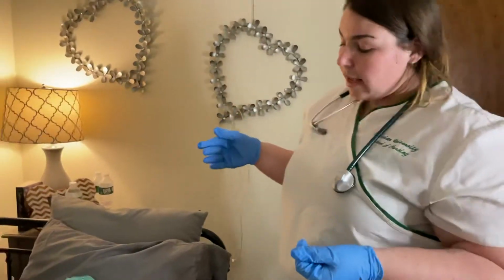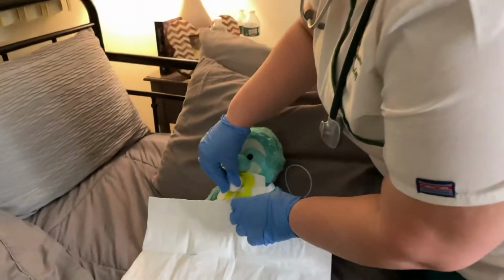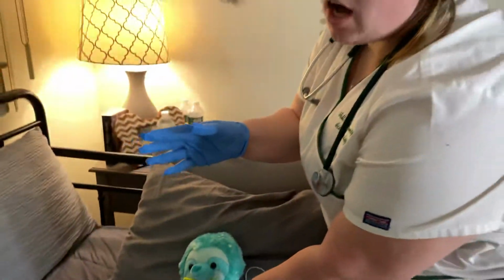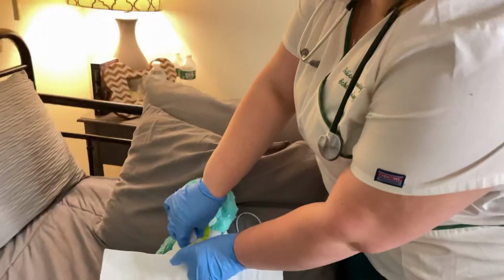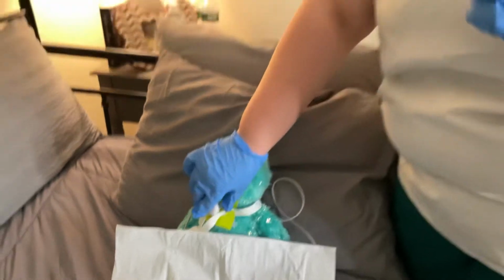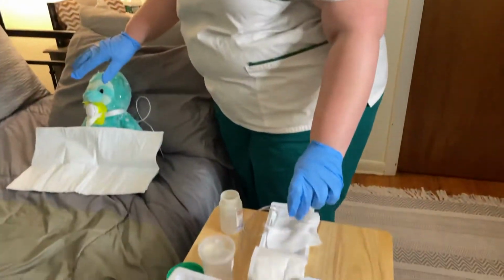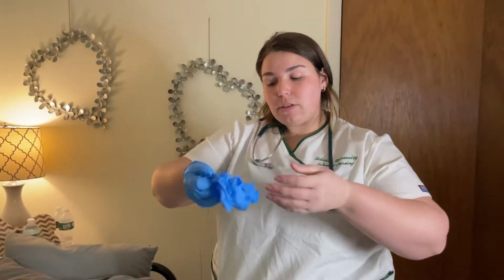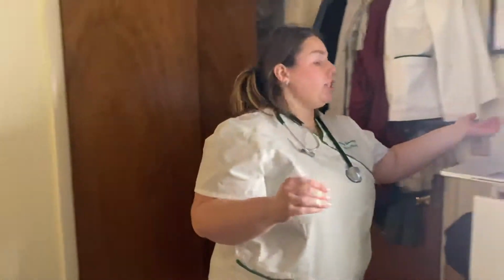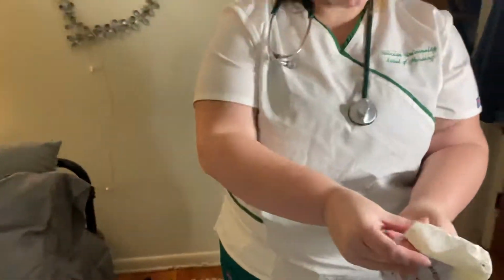We're going to use our sterile hand to remove that dressing underneath. Gently, and you want to make sure that your clean hand is always securing the faceplate so that the tracheostomy does not come out. You're going to dispose of this dressing, and at this point we're going to remove our gloves, dispose of them, perform hand hygiene, and we're going to put on a new pair of sterile gloves.